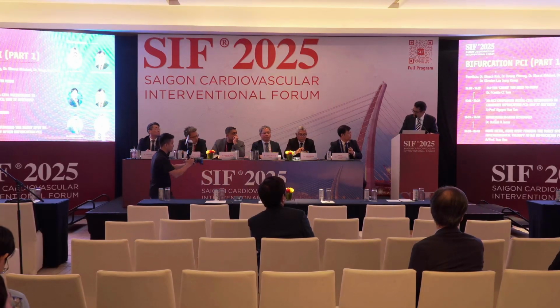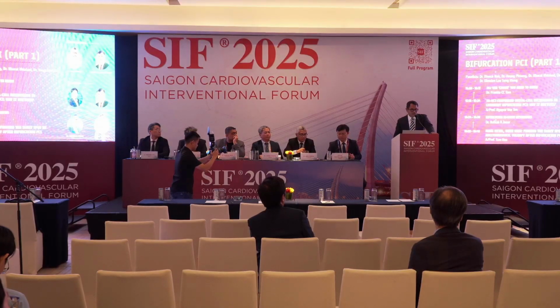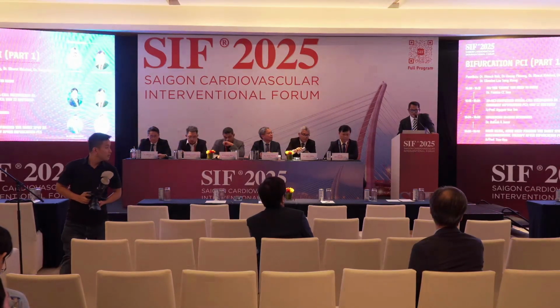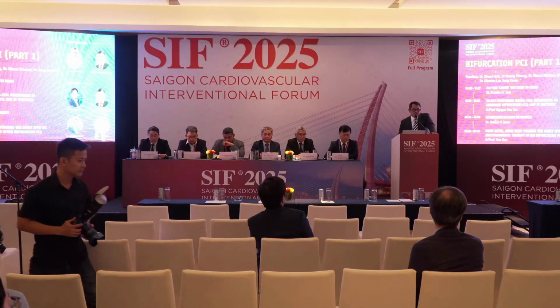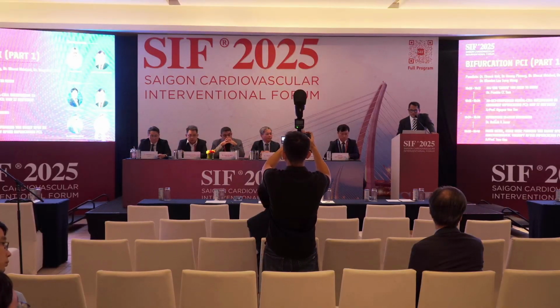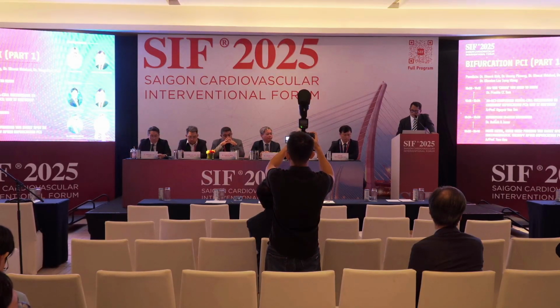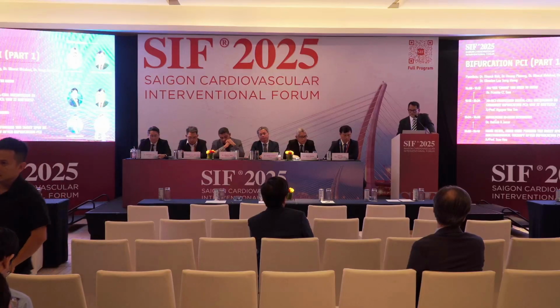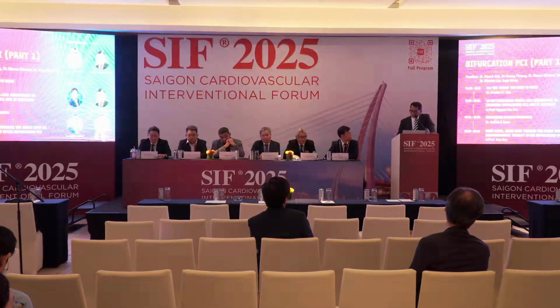Regarding the preparation, I guess it all depends on what's the cause of the restenosis, the mechanism. If the mechanism is underexpansion due to calcification outside the stent, then probably your only choice would be IVL, or you do an atherectomy with a big burr, and then do pre-dilatation. And for neoatherosclerosis with calcification, I guess rotational atherectomy is an option. But I think I missed one point here.